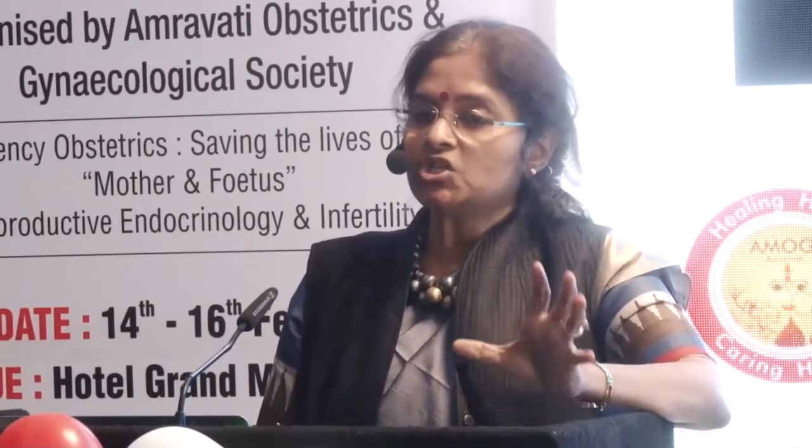My topic for today is timing of third trimester scan for optimizing fetal outcome. The previous speaker, Dr. Sachin, has actually covered a little bit of what I'm going to talk about, so we take it from there. The third trimester scan is actually known as a welfare scan, and it is also known as a growth scan. So essentially what we are trying to see in the third trimester scan is the growth pattern.